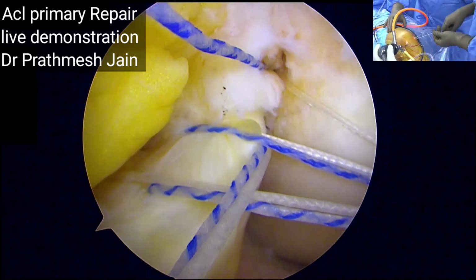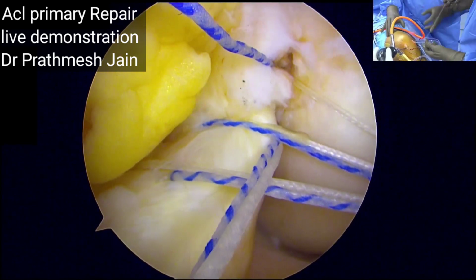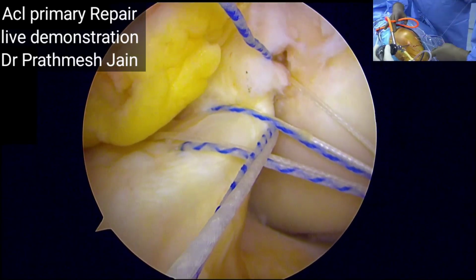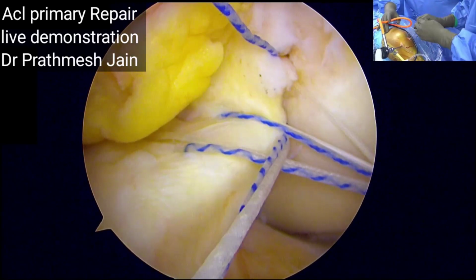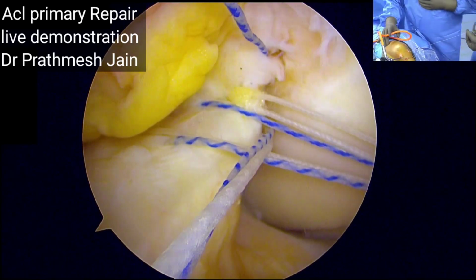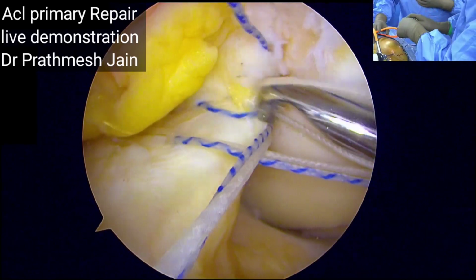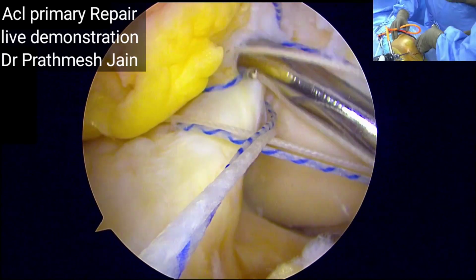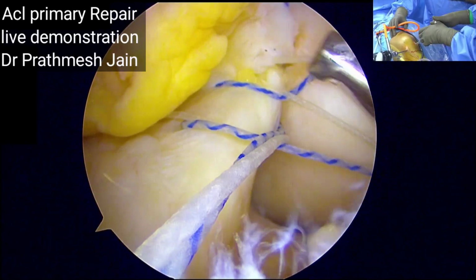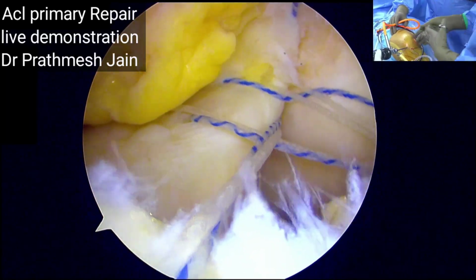And then I would just take a simple knot, which will come like this, and this will close my ACL very nicely into its place. So the first knot will actually close the ACL, and the flipped part of the ACL is now repaired, and we can see a very nicely tensioned ACL back in its position right there.